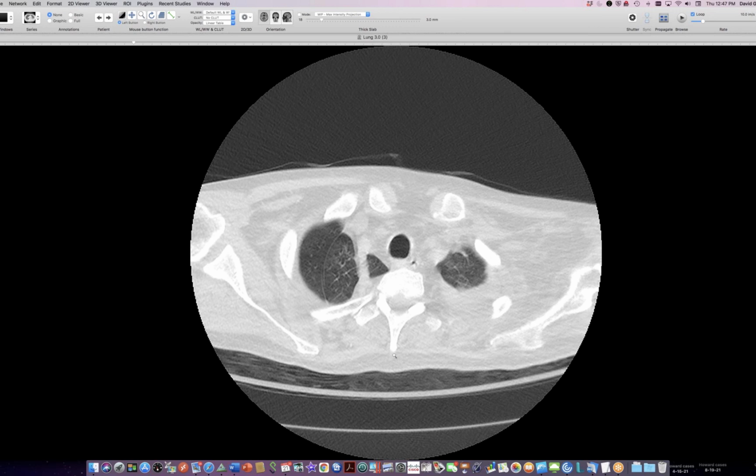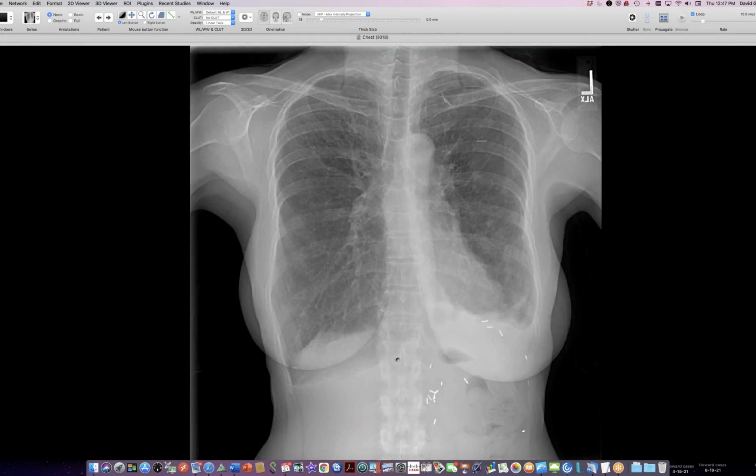Got it. Okay, I have one final case, which is not remarkable, but just has a constellation of findings. This woman has LAM, and she has had pleurodesis because of recurrent pneumothorax on the left. So that's why she's left with this pleural thickening. She also earlier, and I don't have any images in our system, had an angiomyolipoma of the left kidney and has had resection. So her findings are classic.